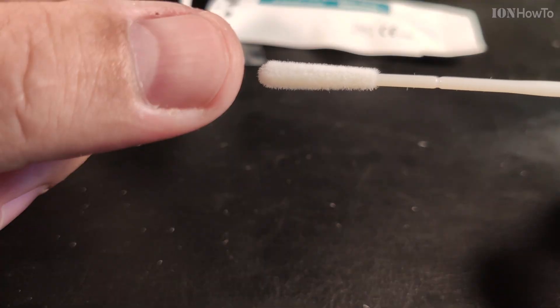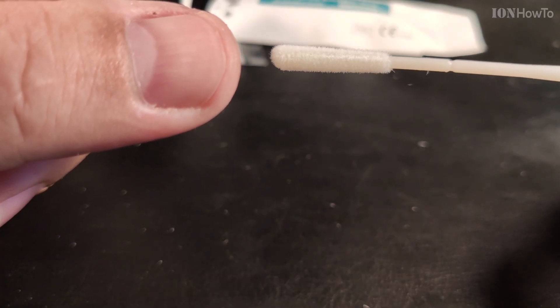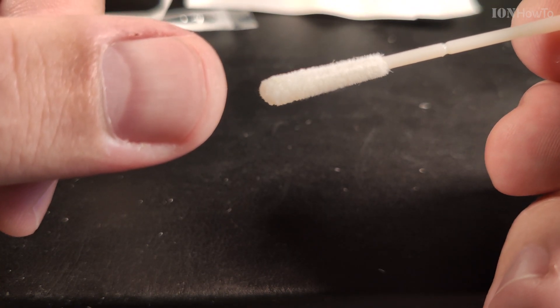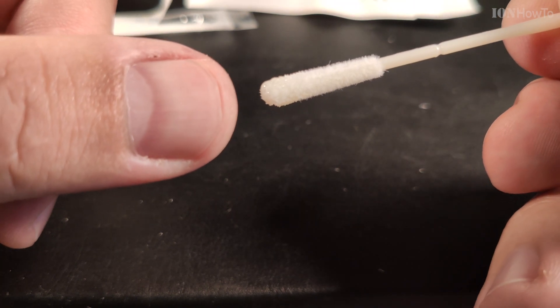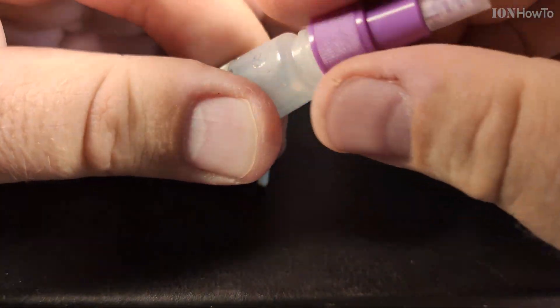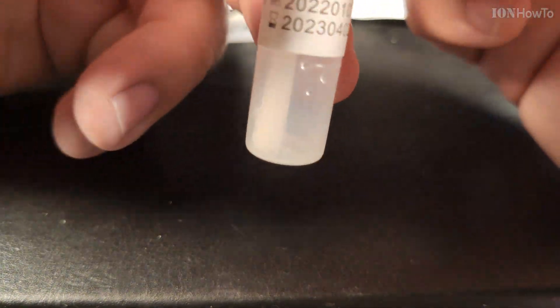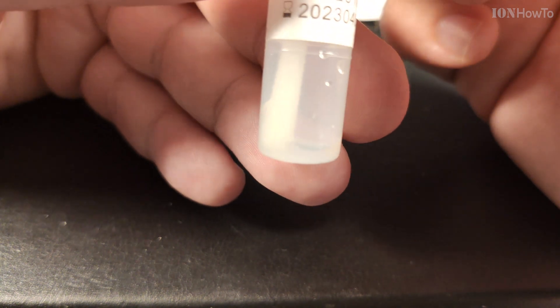The swab is supposed to be put in the nose or even in the mouth. I took a sample — a bit from the nose and a bit from the mouth — and then mixed it with the buffer solution.